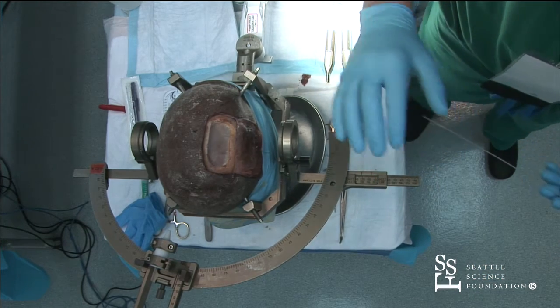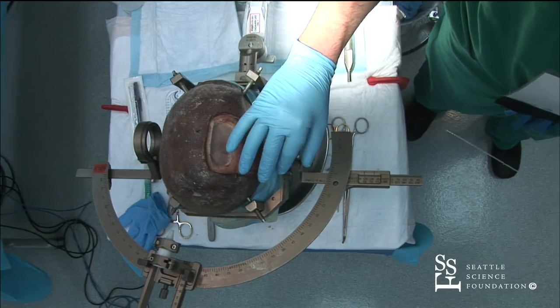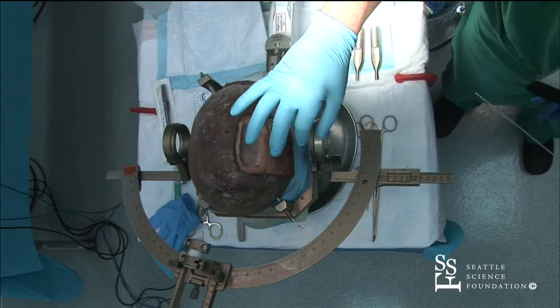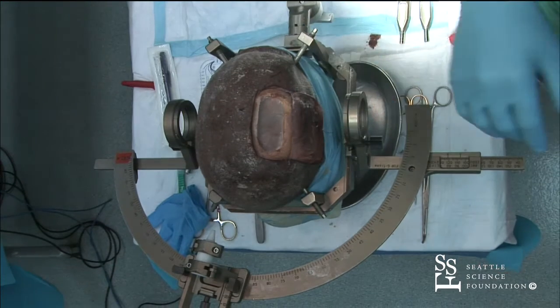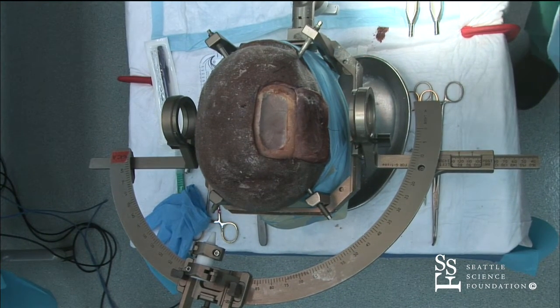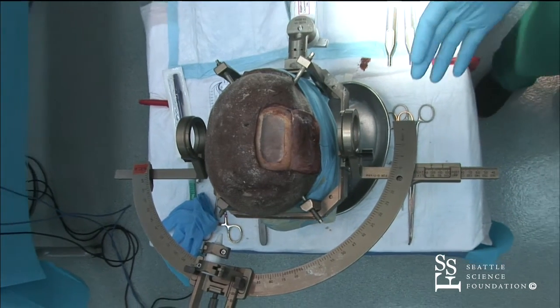So oftentimes, particularly if you're placing strips over like a motor cortex onset, we might put in 4 strips right next to each other, only hook 2 of them up, and then if we don't get good onsets or we're not getting a good response, then come back later and switch out one or both of them to get better onsets. So, but for right now, the most common one is going to be your temporal lobe epilepsy.